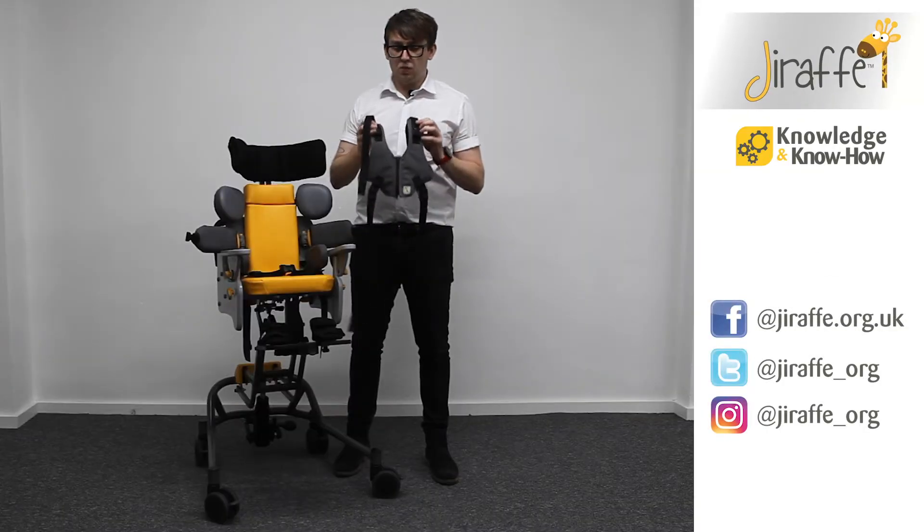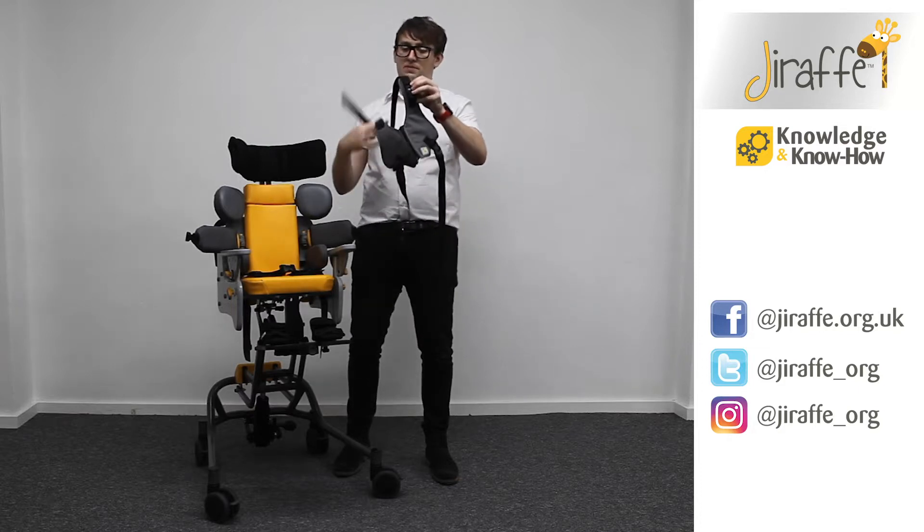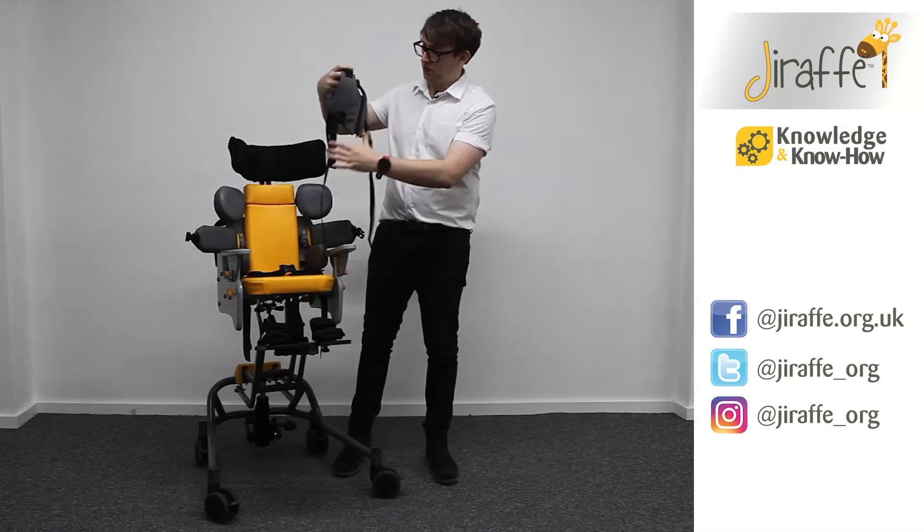I'm now going to show you how to fit the waistcoat harness to the Atom. So we've got four straps to the waistcoat: the two bottom straps and the two top shoulder straps.